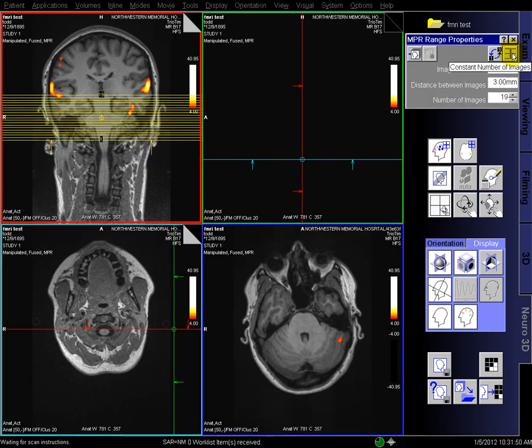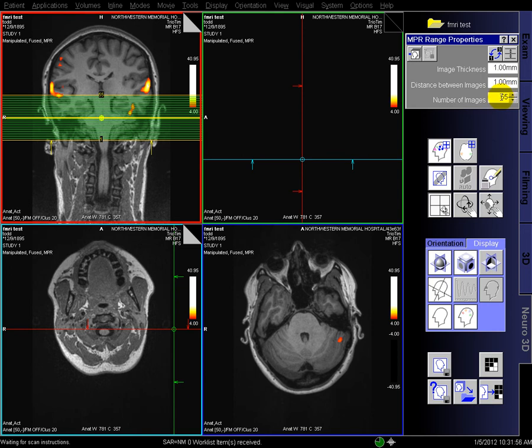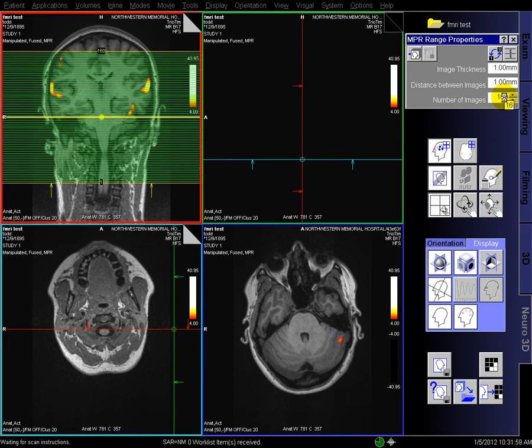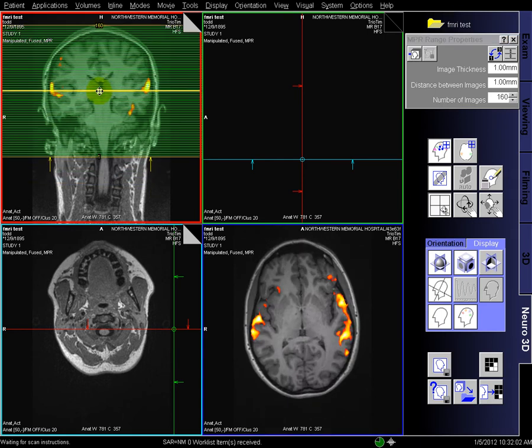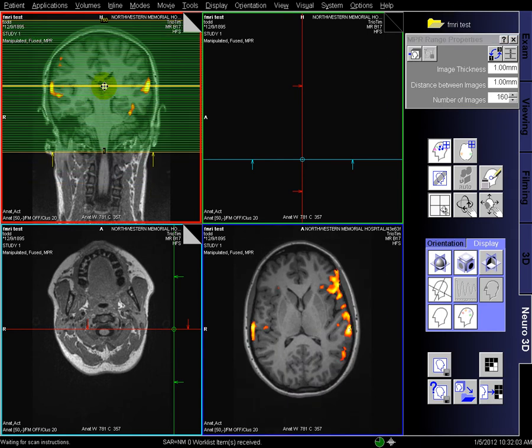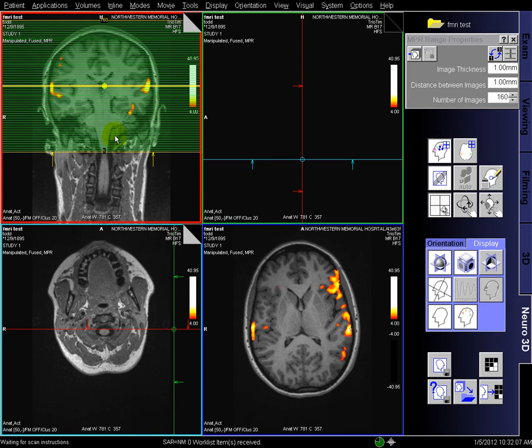you turn off the constant number of images first, and you select that you want one millimeter thick, just like the anatomic underlying data. Pick a number of slices, I usually use 160, and position those over the brain. You want to cover outside the brain so you can render the whole skull in the OR.